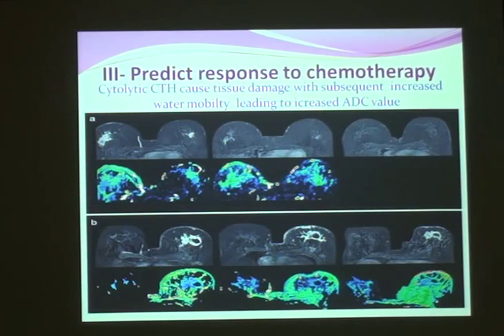This is actually my favorite indication. As we said before, breast cancer could be staged in stages 1 and 2, stages 3 and 4, and stage 4 we consider completely unresectable or non-operable, but somehow there is hope now. As we know, they started to give chemotherapy, neoadjuvant chemotherapy, for newly diagnosed large lesions, and we just wait for the response. It may downstage the tumor and render it from non-resectable to resectable, and this is very hopeful. We have 2 examples.